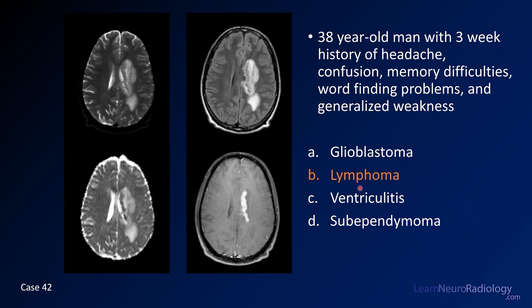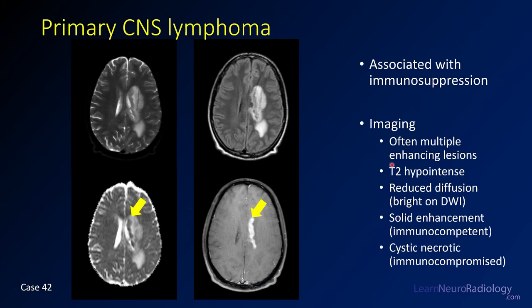This is a case of lymphoma — a pretty classic case. What you have is a nodular T2 hypointense enhancing abnormality along the margins of the ventricle. It's multifocal. It's dark on ADC — on DWI it would be bright. And you've got some FLAIR abnormality around it.